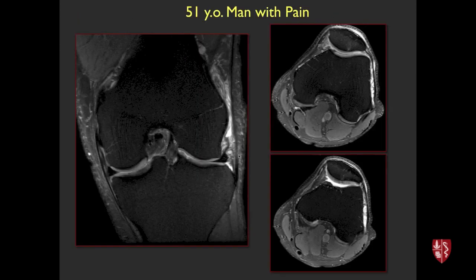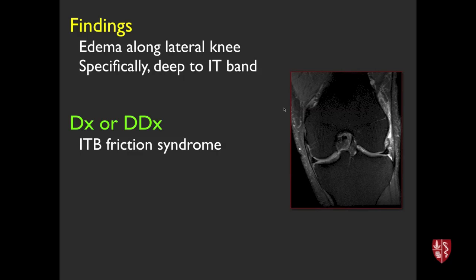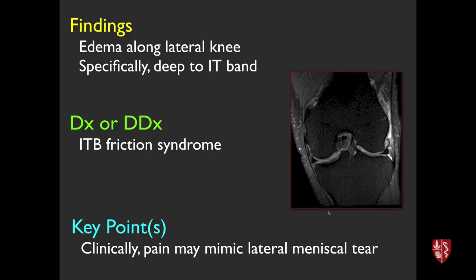51-year-old man with pain. MRI shows edema along the lateral aspect of the knee, along the iliotibial band, with edema deep to it. This is the MR equivalent of iliotibial band friction syndrome. Key point: it may be diagnosed clinically, but symptoms can overlap with those of a lateral meniscal tear. That's often why MRI is done — to rule out a meniscal tear, not necessarily to rule in IT band friction syndrome.